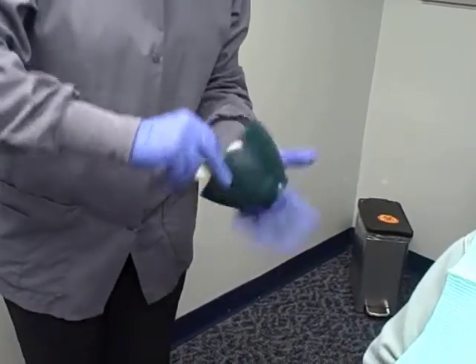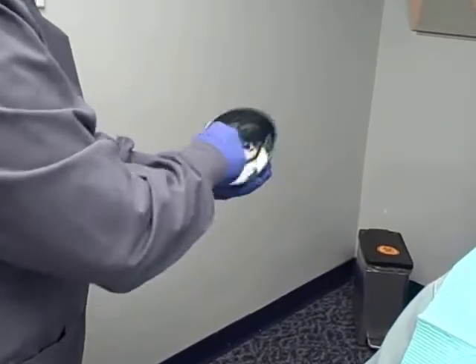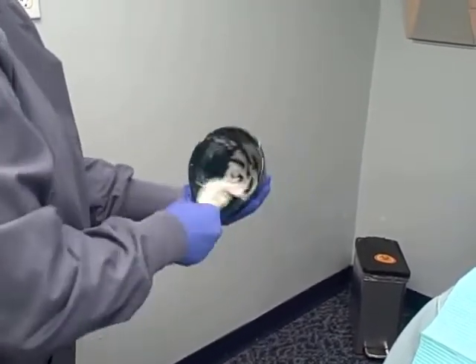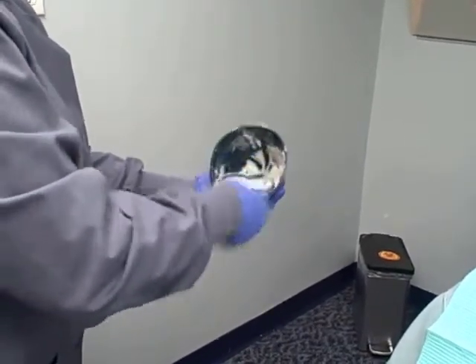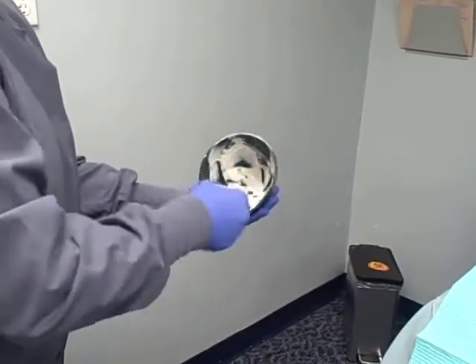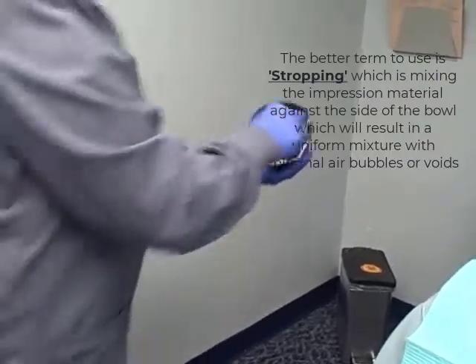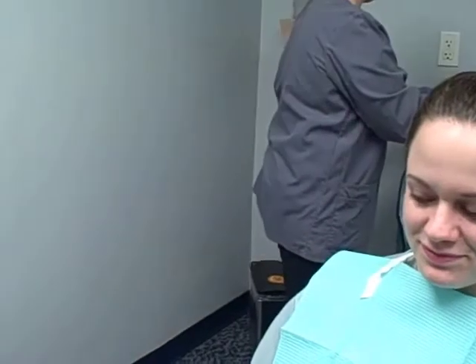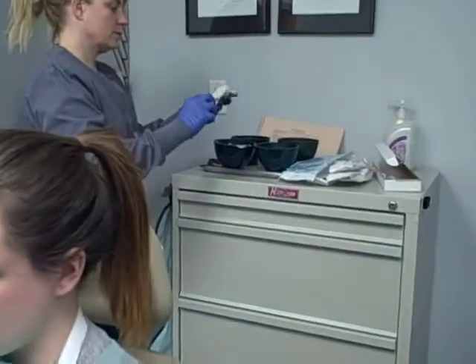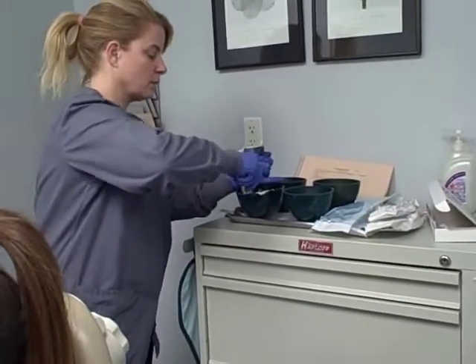You want to move fairly quickly — scooping it all up, kind of smooshing it into the side to get all the bubbles out. Make sure it's thoroughly mixed. I'm going to scoop it up, put it into the tray, load the tray. Need a little bit more.